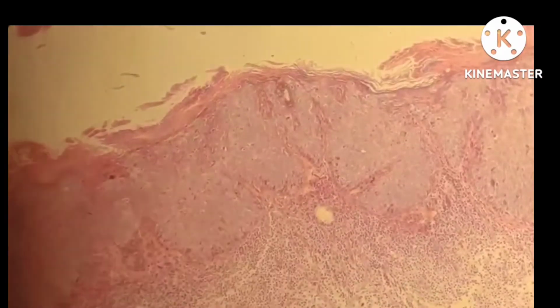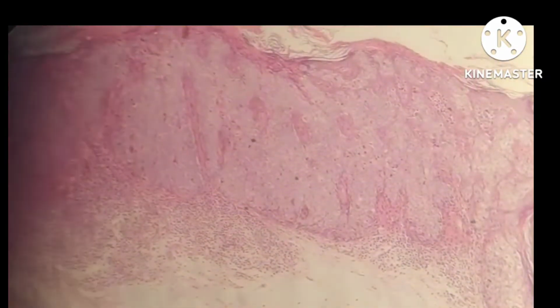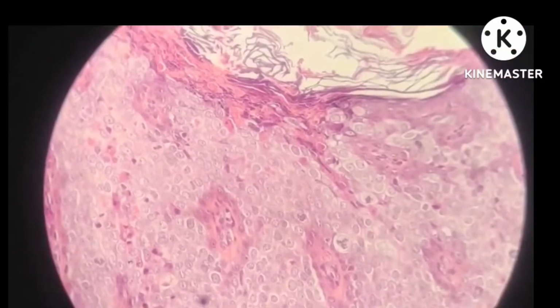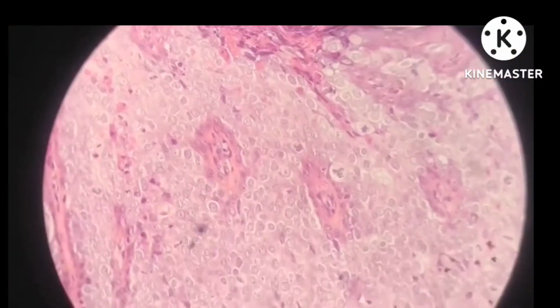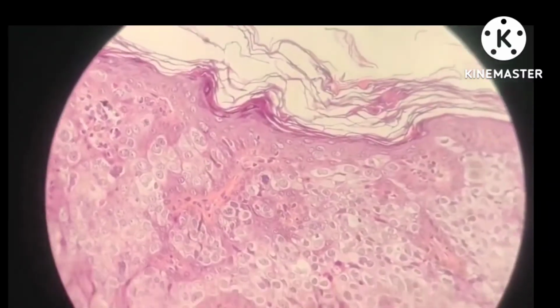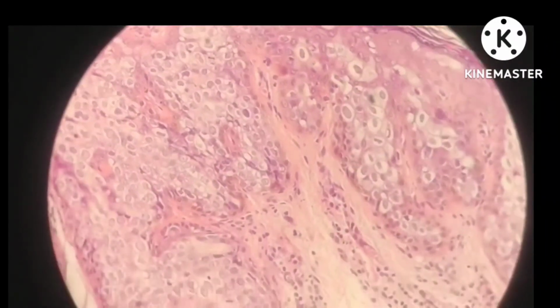Difference exists between bowenoid actinic keratosis and Bowen's disease. They may differ merely in size, with the bowenoid actinic keratosis usually being smaller than Bowen's disease. In some cases of Bowen's disease, there are single atypical cells scattered among benign keratinocytes in a pattern of pagetoid Bowen's disease or pagetoid squamous cell carcinoma in situ. That must be differentiated from superficial spreading melanoma in situ, if necessary, with the use of immunostaining for keratin markers and S100.